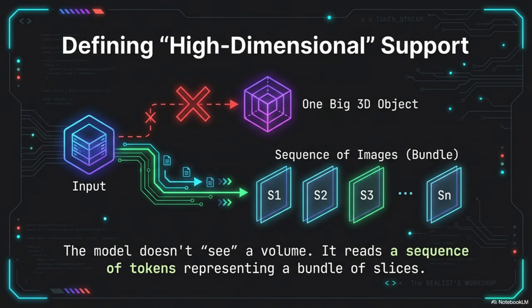And if the input quality is our responsibility, then the environment where we run it becomes critical. This brings us to the next point. Offline capable changes the workflow. If you're serious about building tools in healthcare, running locally is, well, it's the whole ballgame. It fundamentally shrinks your iteration loop.